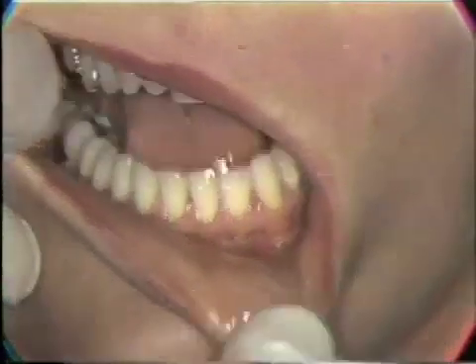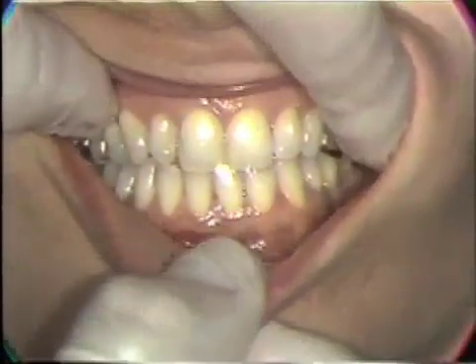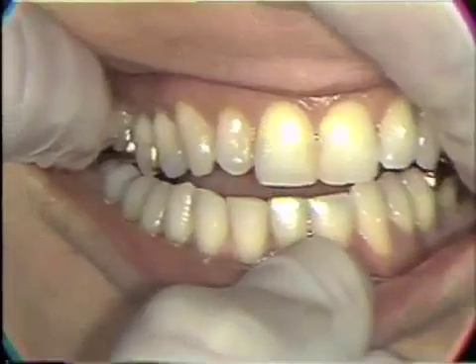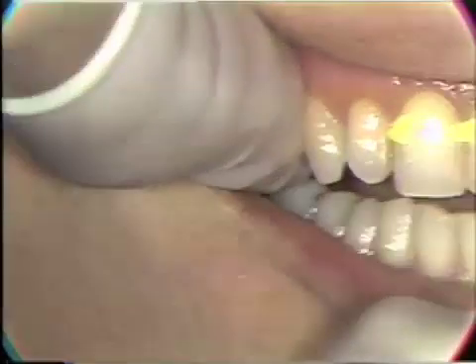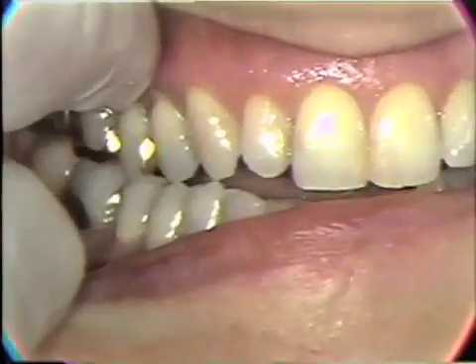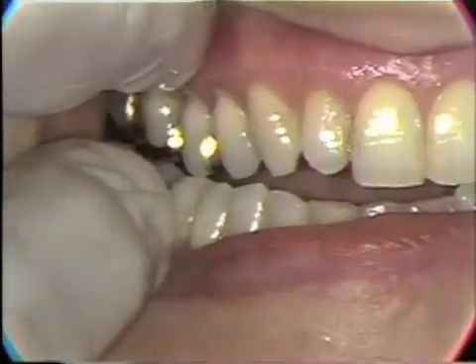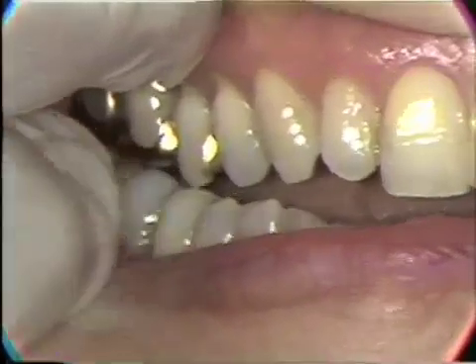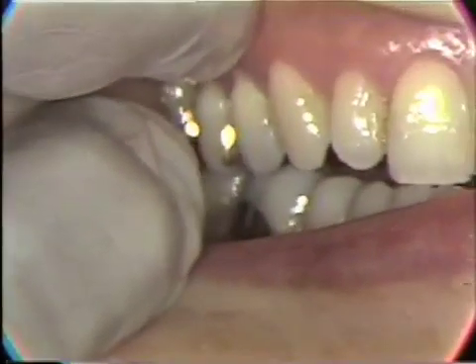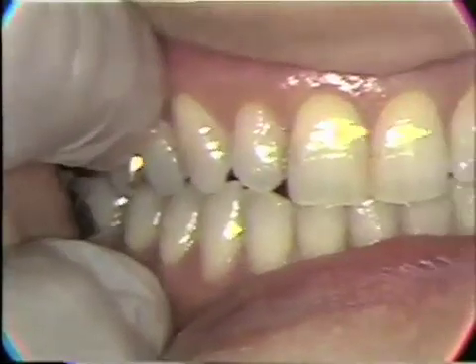The patient closes the teeth together and moves from side to side. There is a tripping on the second bicuspid in the maxillary arch. Notice the movement, and also a similar situation on the left side.